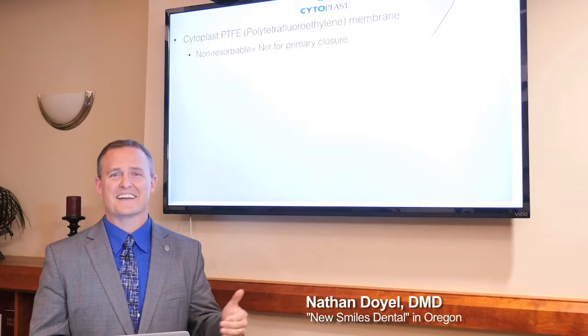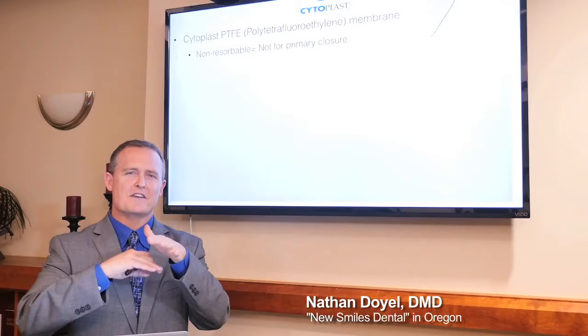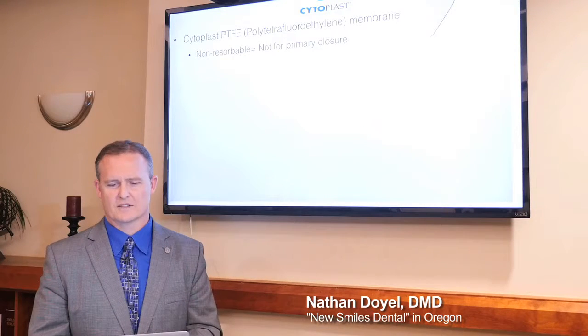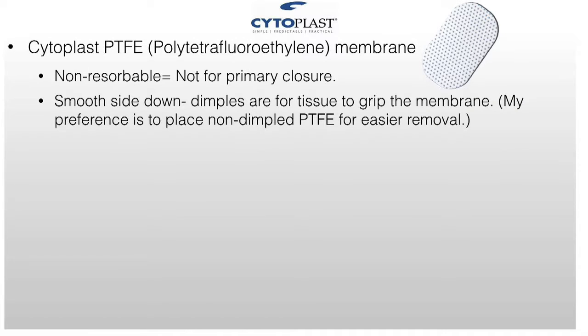Non-resorbable, meaning that it's not for primary closure. You don't want to have primary closure and have a non-resorbable membrane underneath there. If you go that direction, you want a collagen membrane or something else underneath there. Again, smooth side down, because you want the tissue to grow on top of the textured part. But if you're like me, I don't use the textured. It doesn't really matter oftentimes which side you put the dimples on, but there it is for you.